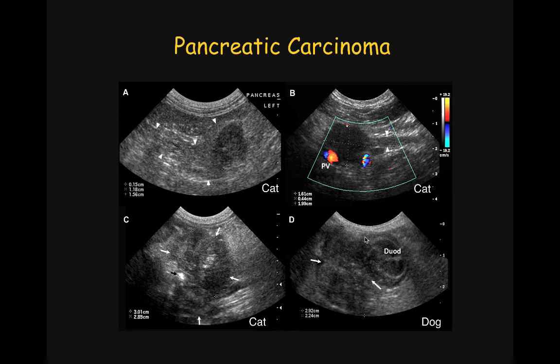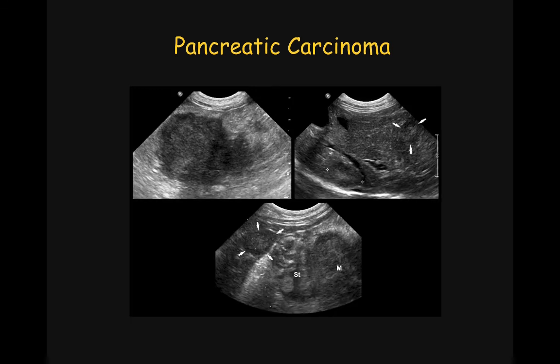Pancreatic carcinomas have a tendency to metastasize to the regional lymph nodes or liver. Here is an example of a large mass reaching over 3 cm, primarily hypoechoic, found in an 11-year-old cat. In addition, we see several target-shaped nodules within the hepatic parenchyma. In this last picture, one of these hepatic nodules is aligned with the biopsy guide, and beyond the stomach we see part of this large mass. Fine needle biopsy confirmed pancreatic carcinoma with metastasis to the liver.